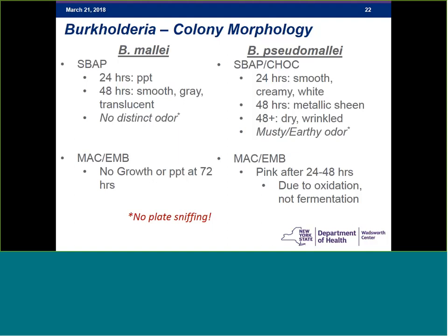B. mallei is said to have no distinct odor, while B. pseudomallei is said to have a musty, earthy odor. However, the practice of plate sniffing is strongly discouraged in the clinical laboratories due to increased risk of infection.